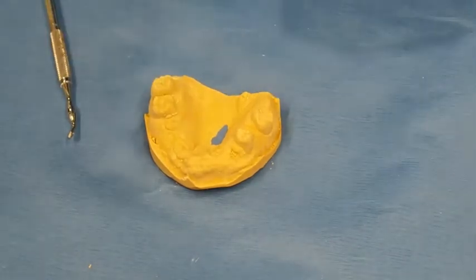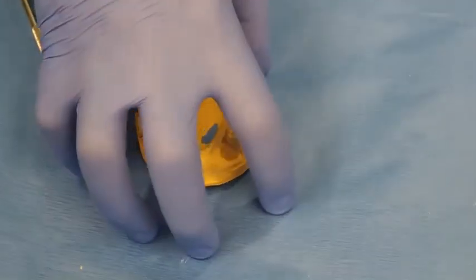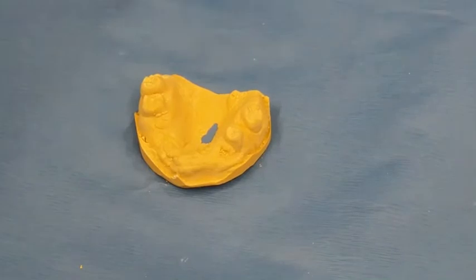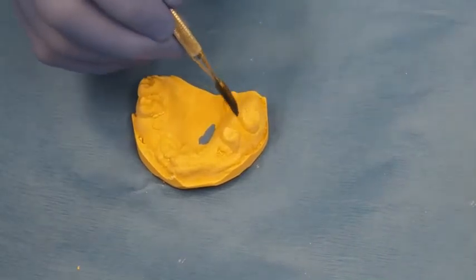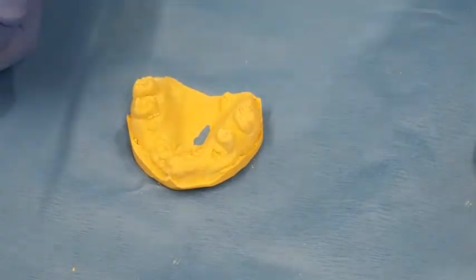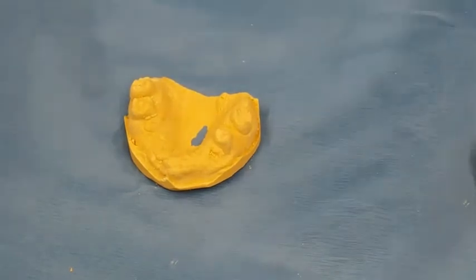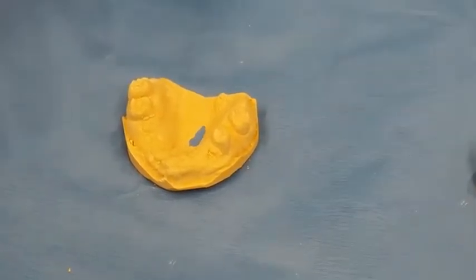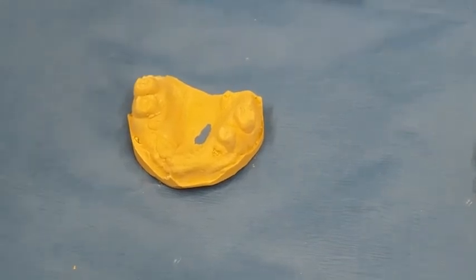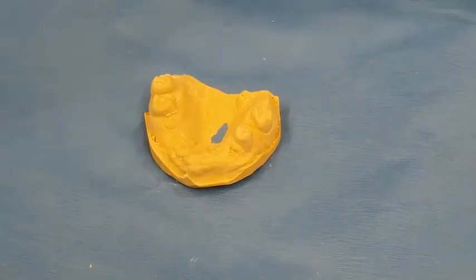On the preliminary impression, we will fabricate a custom impression tray. That custom impression tray will give me a final model, a final cast. I will take the MMR records, mount them on the articulator, and then make the extractions and fabricate that denture. I don't have a tooth try-in. I could, but technically, you might have to try the record base and wax rim to verify your mounting. You could have some teeth on it, but not many.